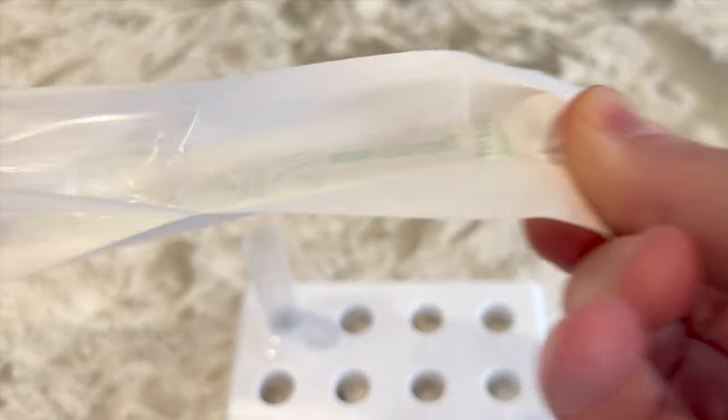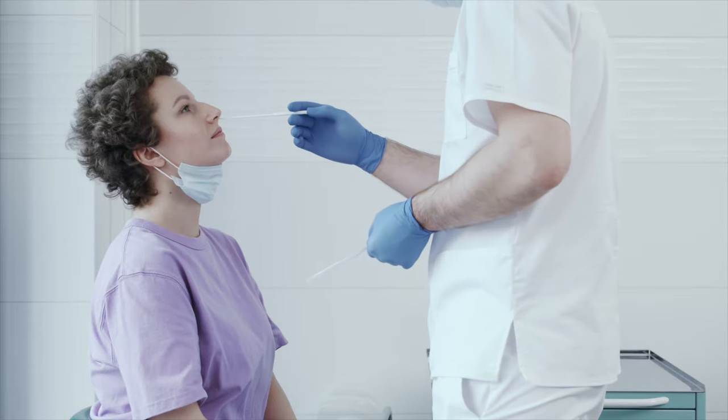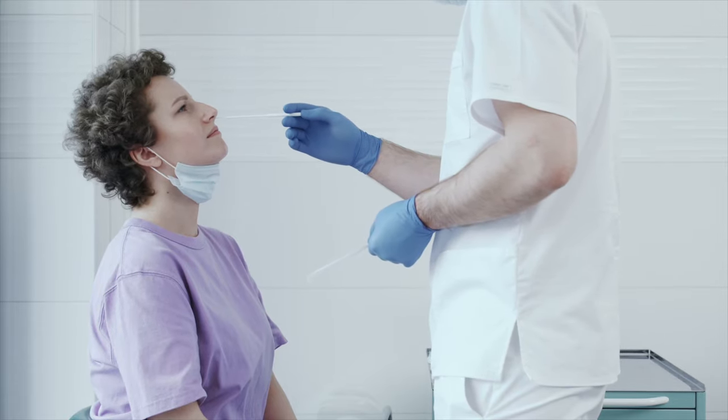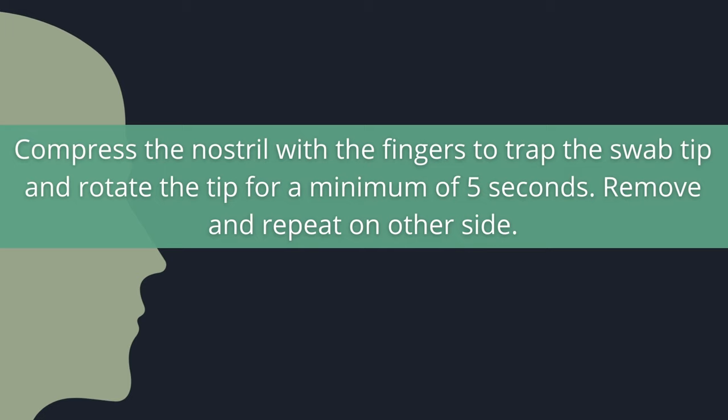Remove the swab from its packaging. Have the person tilt their head back and insert the swab about half an inch inside the nostril. Rotate the nasal swab within the nose for five seconds using a circular motion. Compress the nostril with the fingers to trap the swab tip and rotate the tip for a minimum of five seconds. Remove and repeat for the other nostril with the same swab.